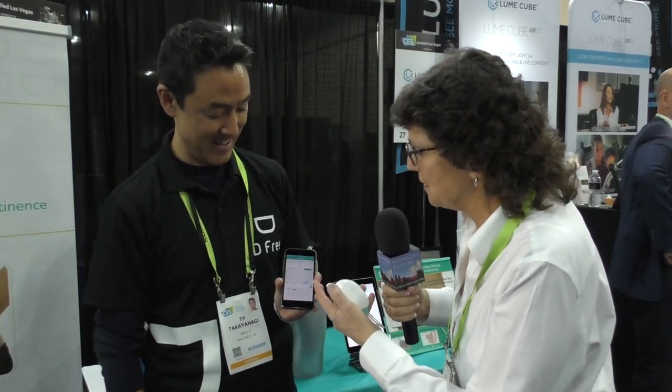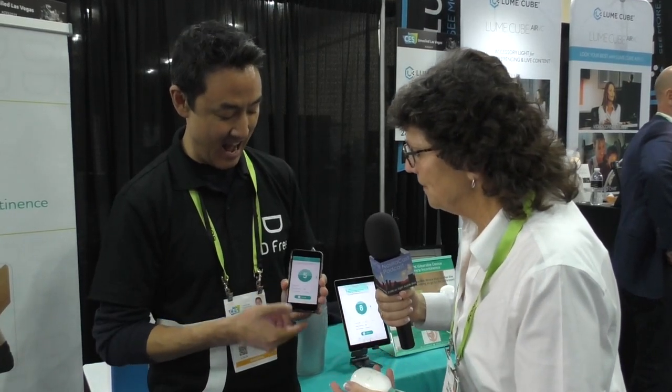The company is Triple W and the product is DFree — short for diaper-free. You can find it at dfreeus.biz and they also sell on Amazon. Before wrapping up, Tai checks his app one more time — still at 50%, so he's good to go. This seems like a really cool product that could help a lot of people be a lot less embarrassed.